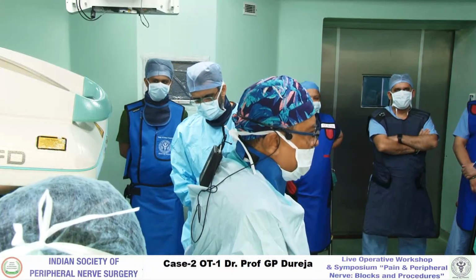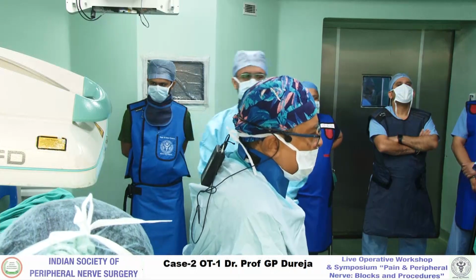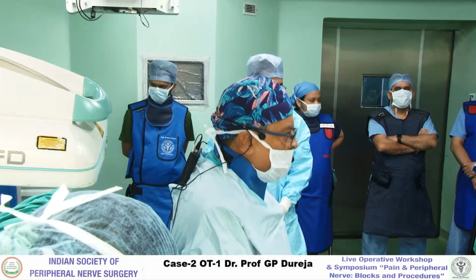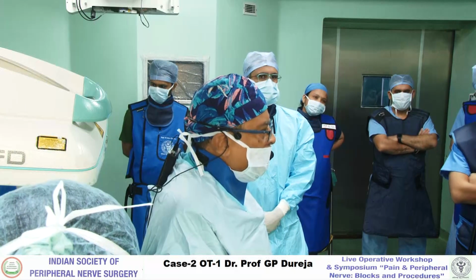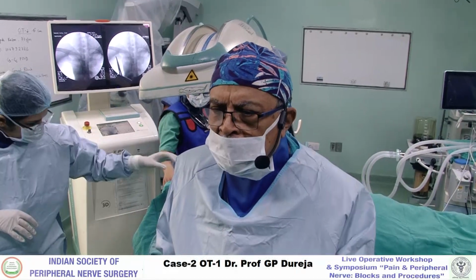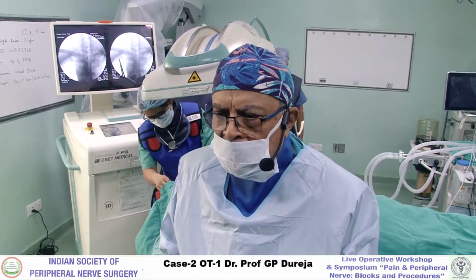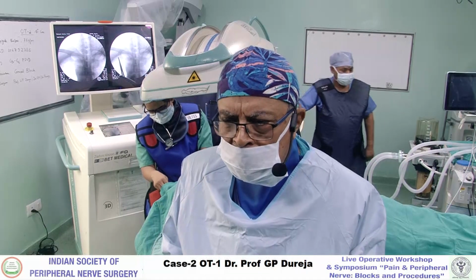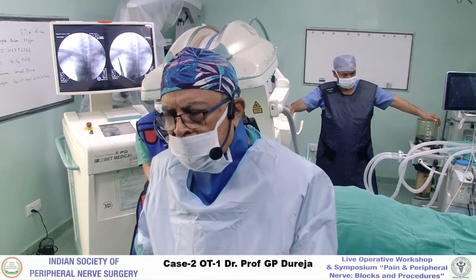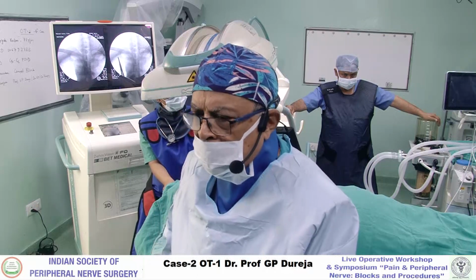As you can see from the MRI, there is a lateral recess compression of the nerve, and it is essentially the radiculopathy which is troubling. As we were discussing in the morning, we have abandoned the cervical root sleeve block which we were doing about 20 years ago because of the spinal artery being very close to the nerve. So we are doing a cervical epidural, and as we will demonstrate, you have a fairly good spread along the nerve roots. This is a C5, C6, C6, C7 disc bulge, so we will be going from the C7, T1 interspace.